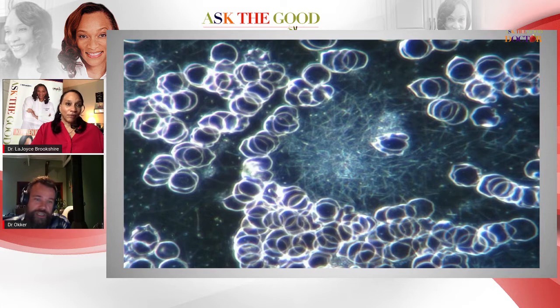People notice this as well, and they realize this when they come for the analysis, that there's no real way for the practitioner to affect these results. The blood goes out of the finger straight onto the slide. What we're seeing is what's going on there. We're not able to cheat the system, and at the same time, patients are also not able to cheat the system if they've not been following your recommendations. You can also see when things are not going the right way.